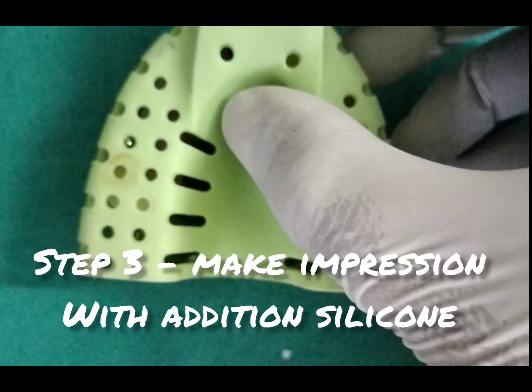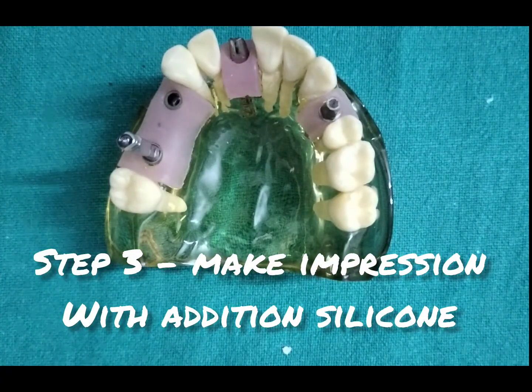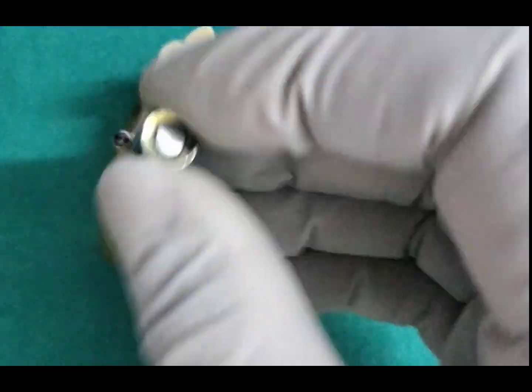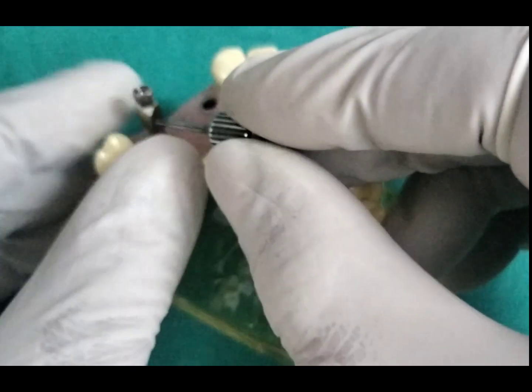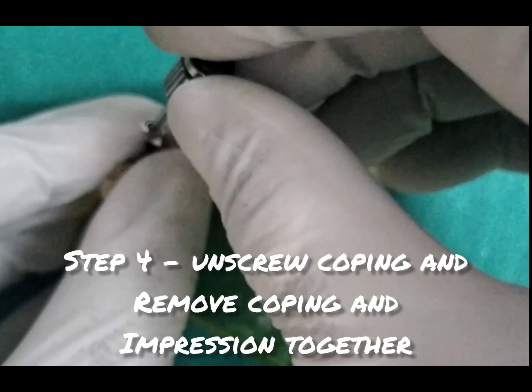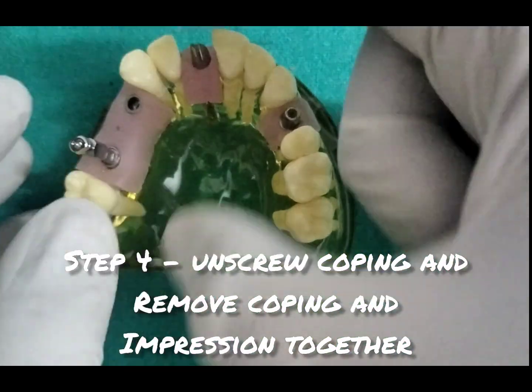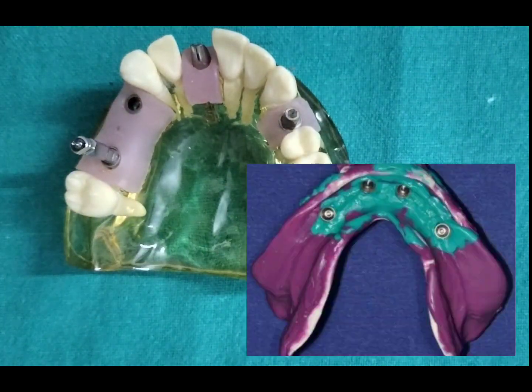So you make the impression using addition silicones, and after the material sets you unscrew. So this portion of the impression coping is outside the tray. You just unscrew this and remove the entire assembly. So we remove the entire assembly of the impression and the copings together.